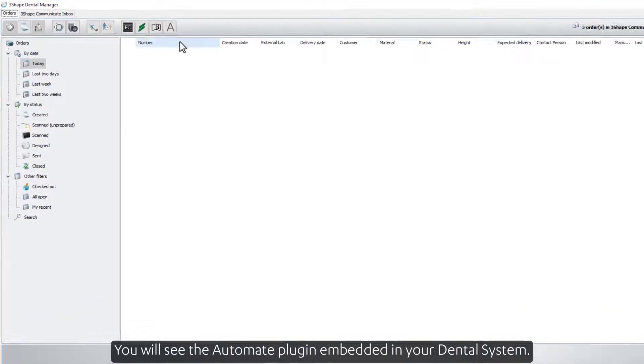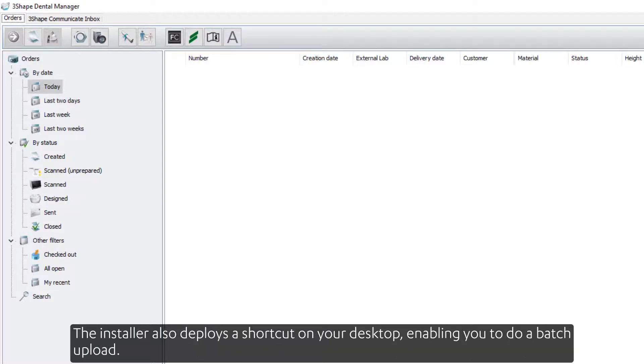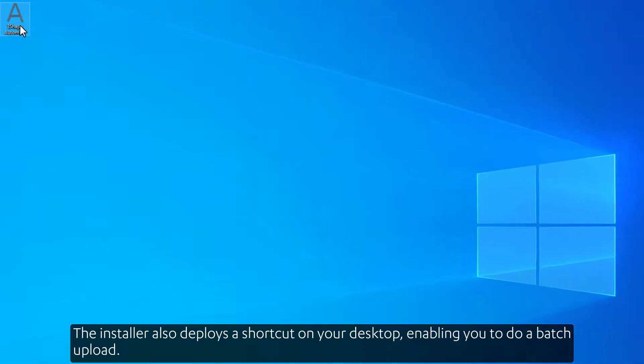You will see the Automate plug-in embedded in your dental system. The installer also deploys a shortcut on your desktop, enabling you to do a batch upload.